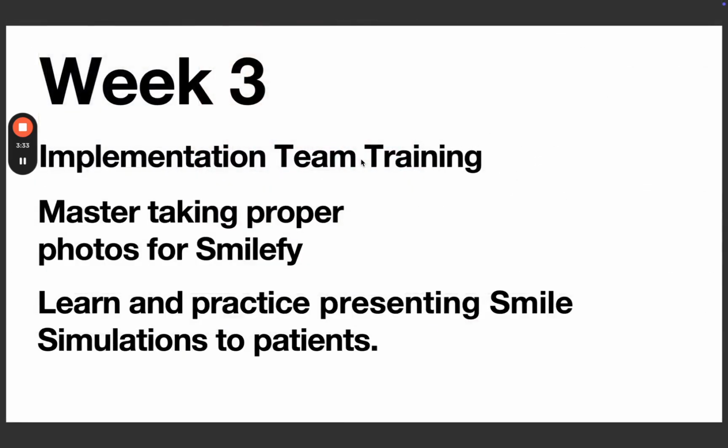On the last week, it's all about the team training. We invite your team members to join this training. This week is designed specifically for your team to understand how to take the proper photos for SmileFy and learn and practice presenting the smile simulations to your patients.